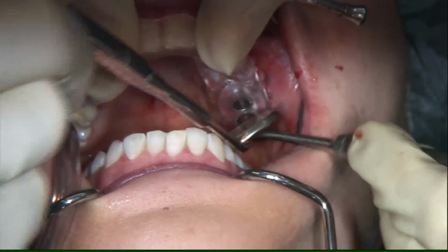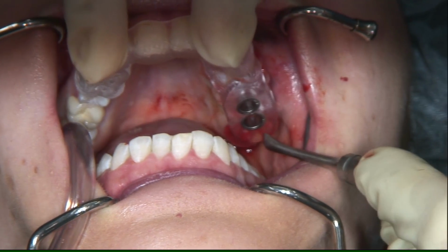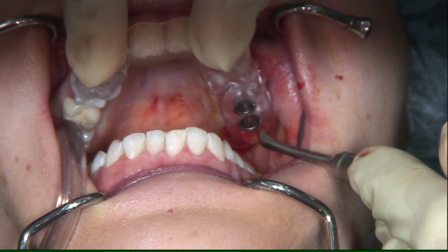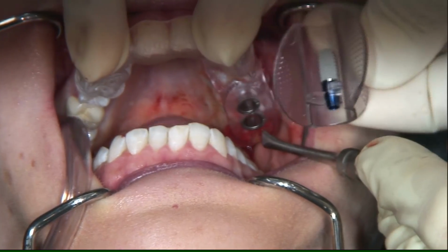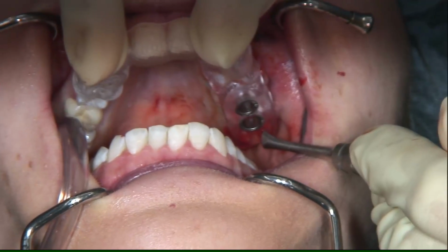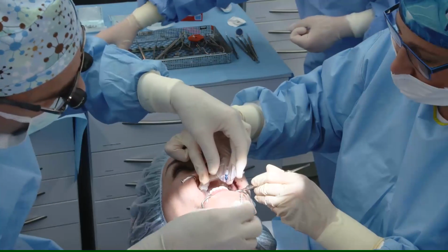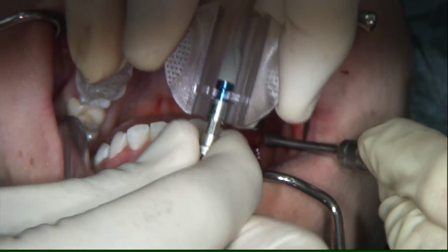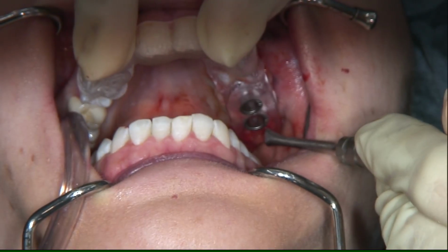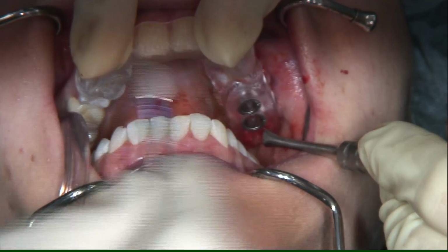And now we are ready to place the implants. What we did now was just leveling the bone a little bit, because we had a small disturbing part of bone. And you see here the use of the blister, or how we take the implant out of the blister.